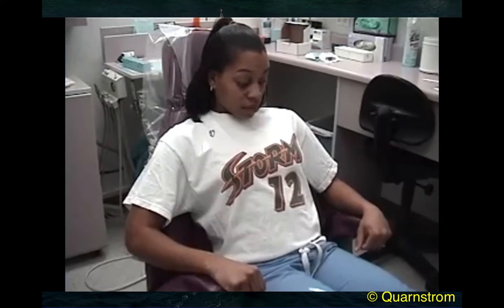One of the things that can happen is if you have a patient who has an obstruction, you will see a rocking motion to their chest and tummy, much as you see here. Dee Dee's doing a pretty good job of showing what you'll see. And although it looks like she may be breathing because you're seeing movement, in actual fact, the patient who's obstructed will be moving like this, yet they won't be moving any air at all.